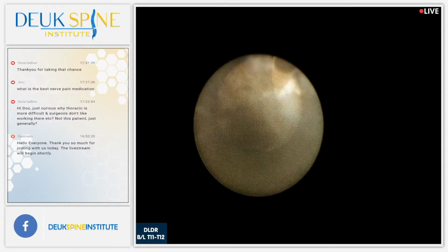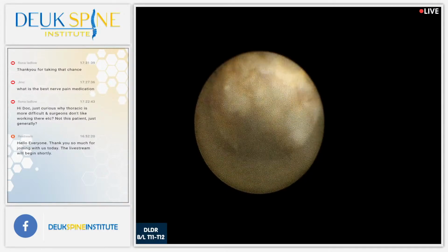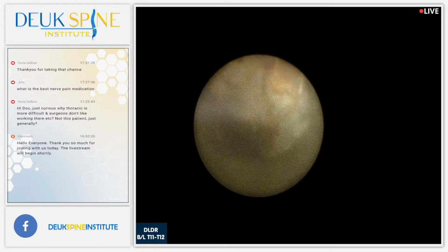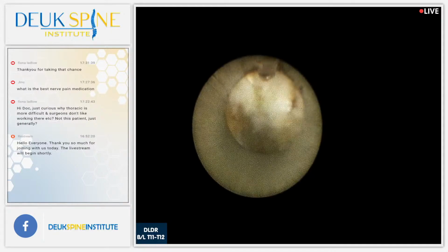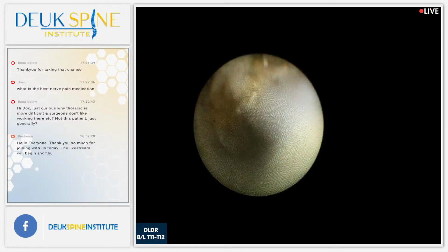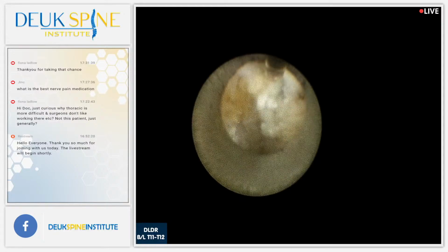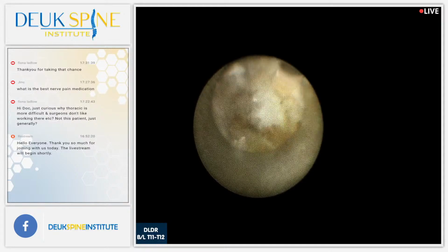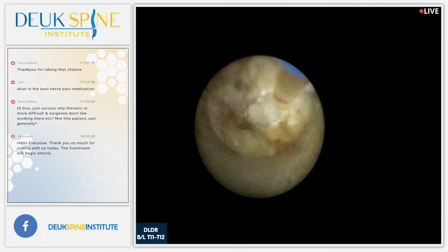As I said, she's been here before. She had her back fixed, she had her neck fixed, and now she's getting her thoracic spine fixed. And we never treated her piriformis definitively, and now we're doing her piriformis too. I think this is going to go a long way to help. This is a pretty good decompression here. I'm pretty happy with this. Just about done. We've created a nice void for what's left of the herniation to have some more room, so it doesn't crush the spinal cord anymore. So I'm pretty happy with this.